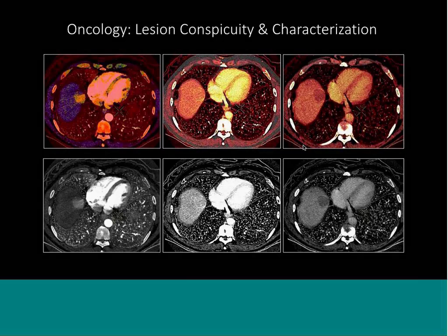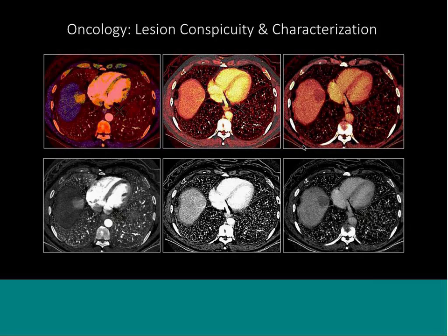As I mentioned, life is easier with dual energy CT, and that's what my task has been, and is going to continue to be, to try to convey to everybody: referring physicians, you guys, and my colleagues. This is a patient, and we see this all the time, who's undergoing HCC evaluation and has cirrhosis. And we have to find all the lesions.